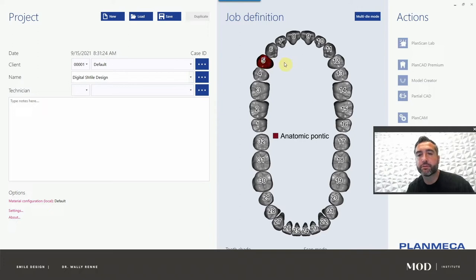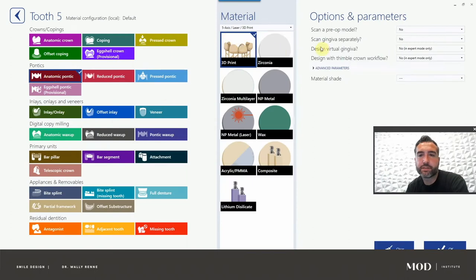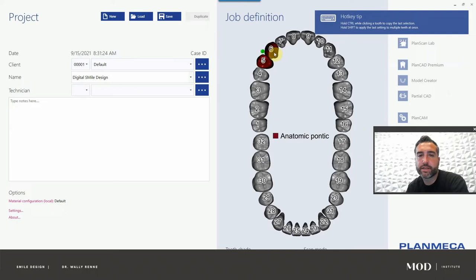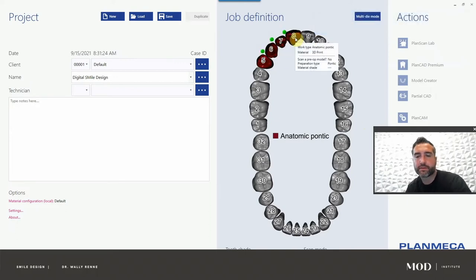We're basically going to combine these into a wax up, then 3D print it and make a putty wash. We'll do a shell provisional tutorial at a later date. So now we have tooth number five: anatomic, pontic, 3D print, no gingiva. We want to copy it over to the other teeth — you can click a tooth and drag it, or hold shift and click. There's a lot of powerful things with the setup tab that eliminates a lot of the monotony.